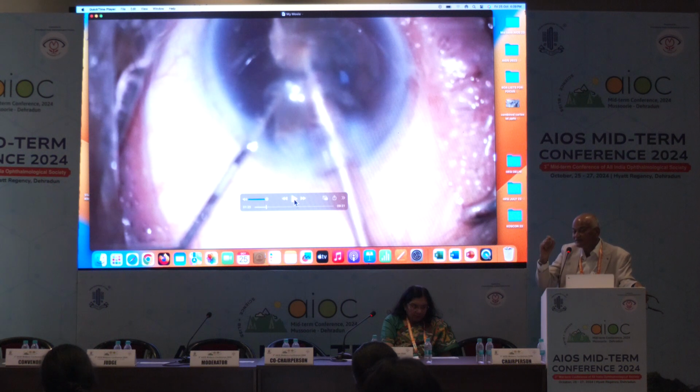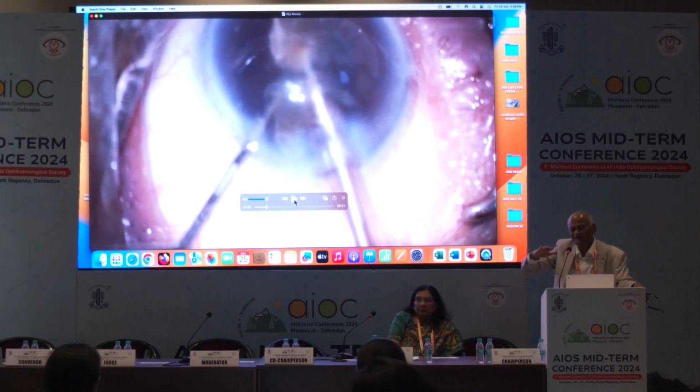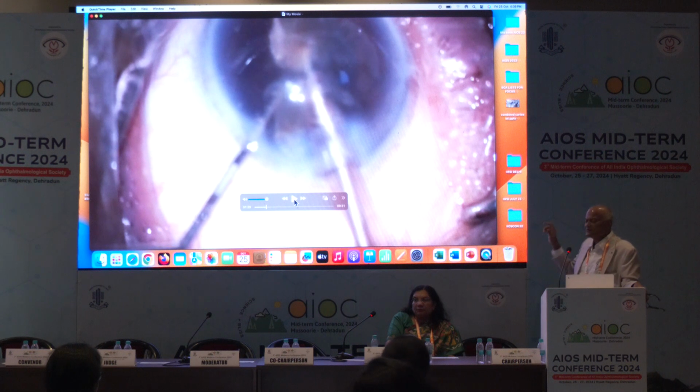Once you are finishing the third piece, on the fourth piece, before going to the last piece, if you have made 4 or 5 pieces, then your speed should be reduced to half. Every speed should be reduced to half. The other question you will ask me is whether you will change the parameters. No. Your foot control should be the control of the parameters.